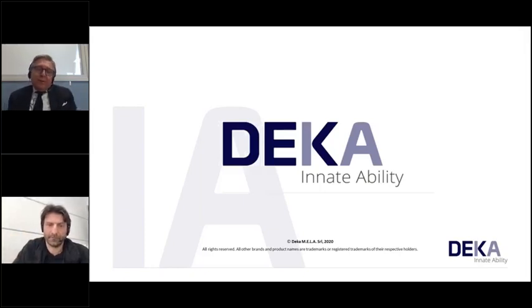If you have more superficial acne scars, I would stay around 8 watt, just around 500 as dwell time and stack 2. So these are my parameters, just a tip in this kind of application.